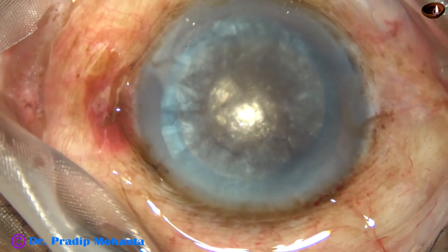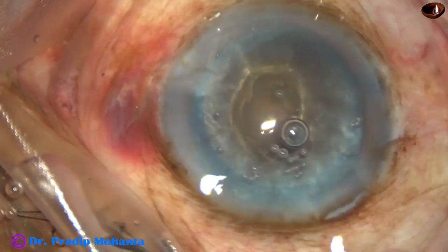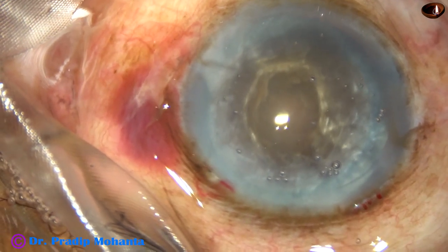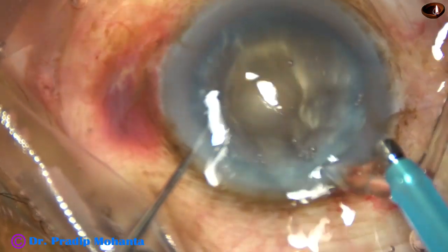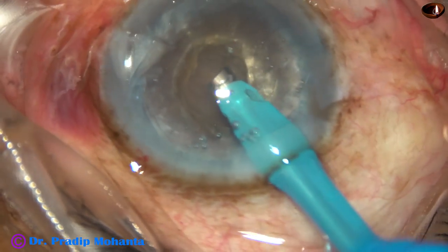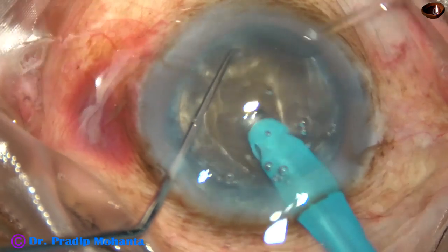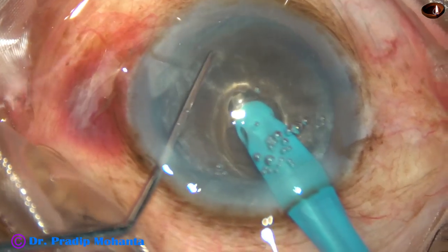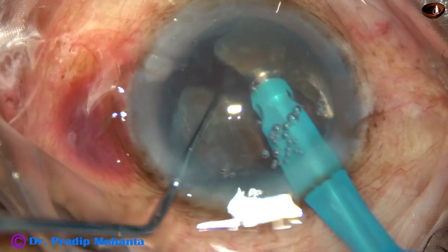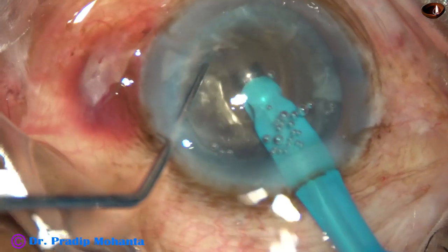Now we can see this is a very hard cataract — nucleus sclerosis is about grade 6. In such cases I do crater and chop technique. I make a crater at the center of the nucleus — this is one kind of debulking. Then I go with the phaco needle, make the bevel up towards the cornea and go at the floor of this crater, hold the nucleus very firmly and chop it. This debulking helps a lot and the nucleus divides easily into fragments.